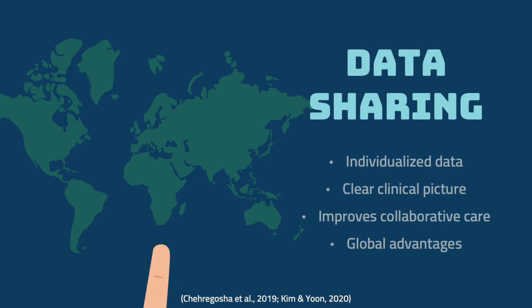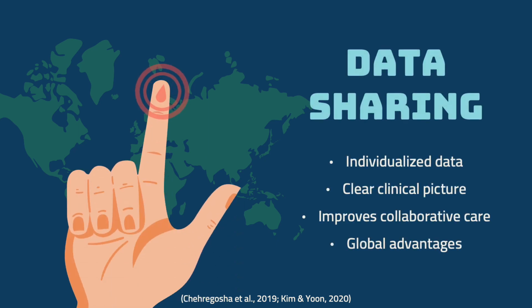Patient-generated data through continuous glucose monitoring can be linked to digital technology shared by their healthcare provider. Individualized data is used for diagnostic purposes and is the basis for decision-making and patient counseling. In order to maximize the benefit of this data, sensors should be worn continuously, and patients should receive teaching on the proper use of data collection technology. On a broader scale, databases containing continuous glucose monitoring information are being used to improve intuitive algorithms that will continue to advance this technology at a global level.